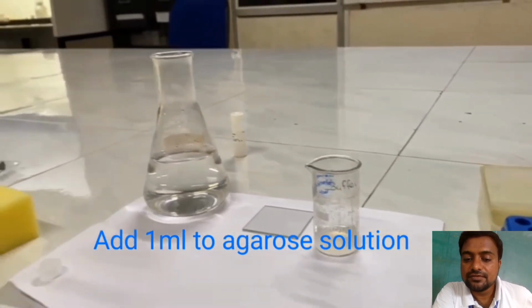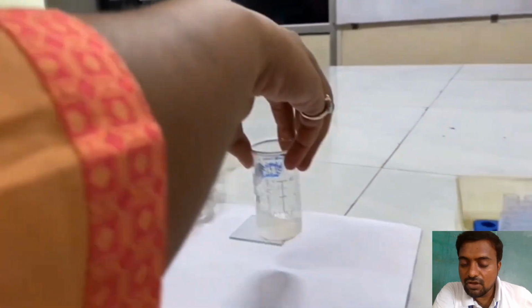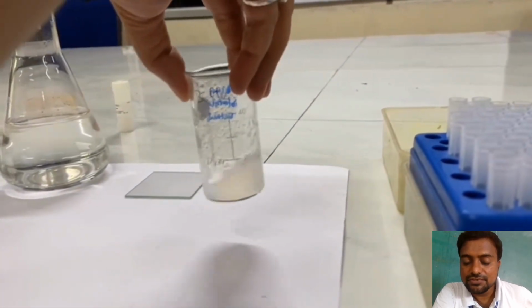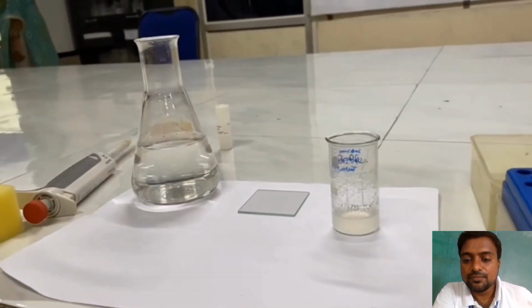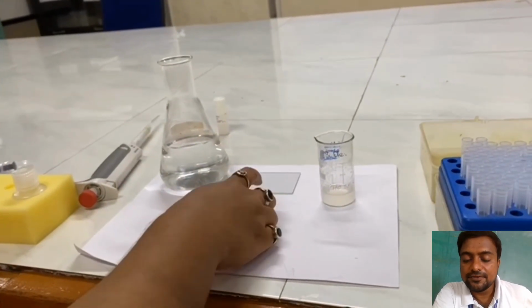Ensure that the antibody is not added to hot agarose solution, because this may lead to denaturation of the antibody. So extreme care must be taken that the temperature is appropriate for the antibodies to be added.